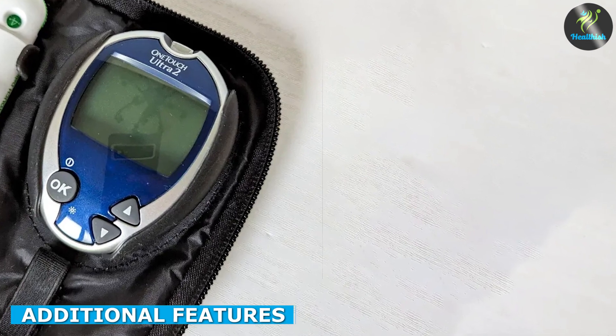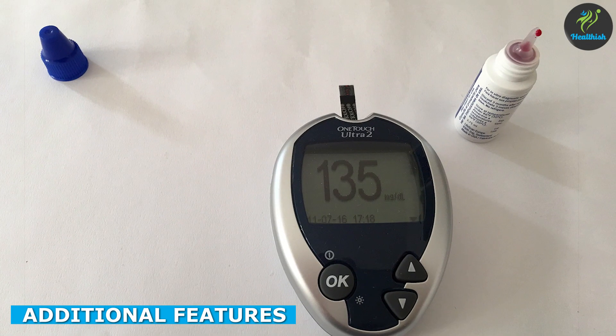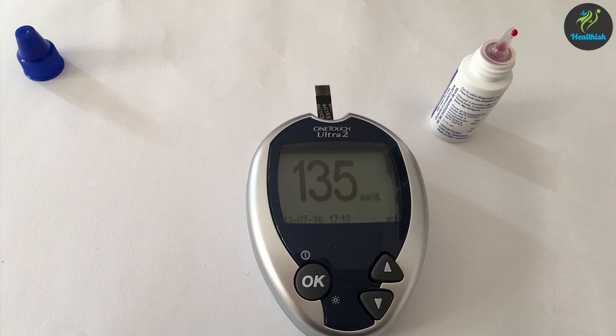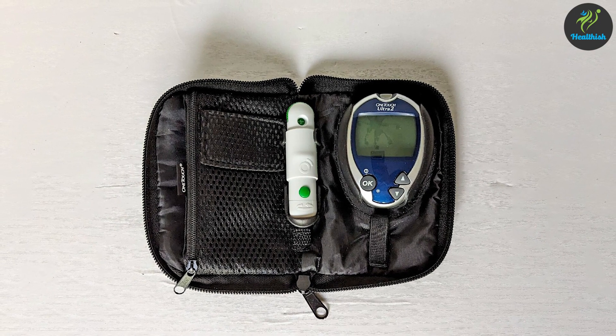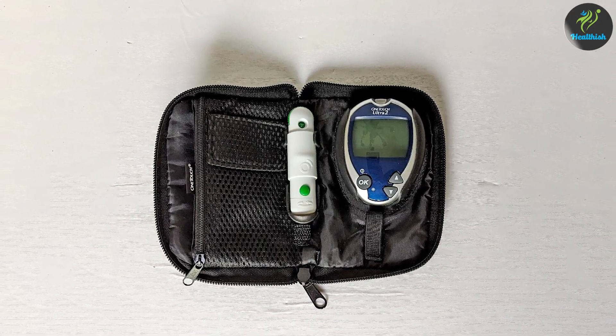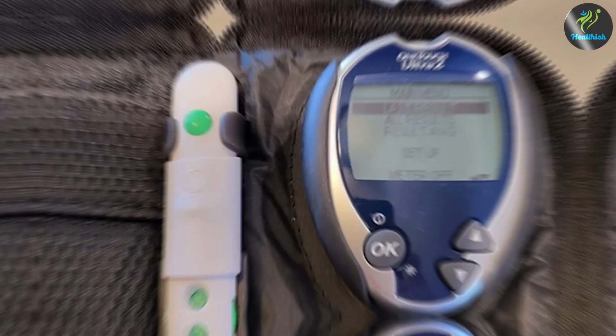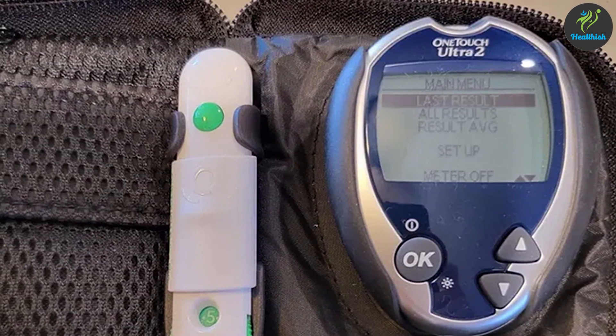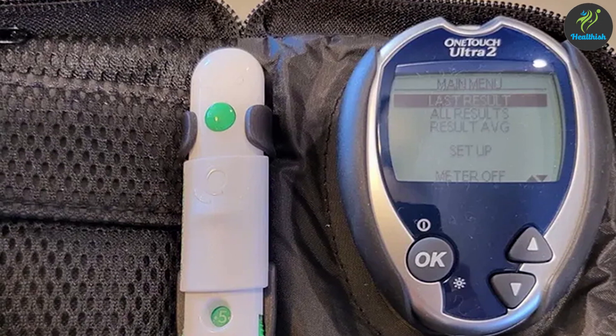Apart from the core functionalities, the OneTouch Ultra 2 also includes some additional features. For instance, it provides before and after meal markers, allowing you to track your blood glucose levels in relation to your meals. The device also offers a hypo-indicator, which alerts you when your blood glucose falls below a certain threshold, helping you effectively manage potential low blood sugar episodes.